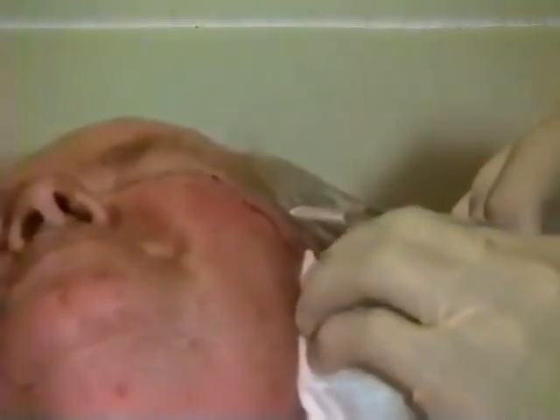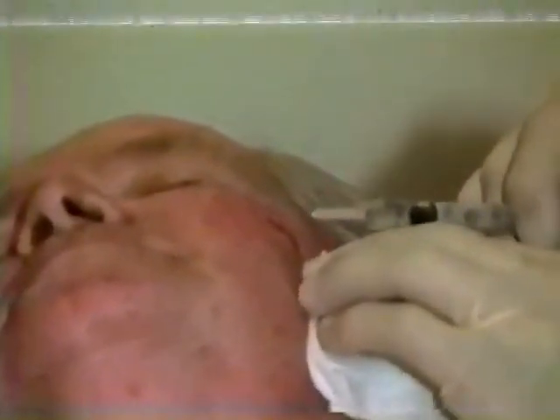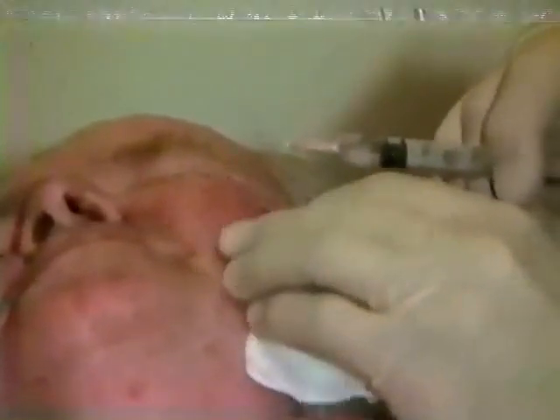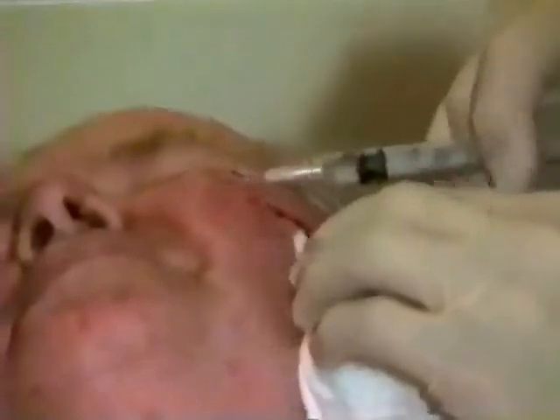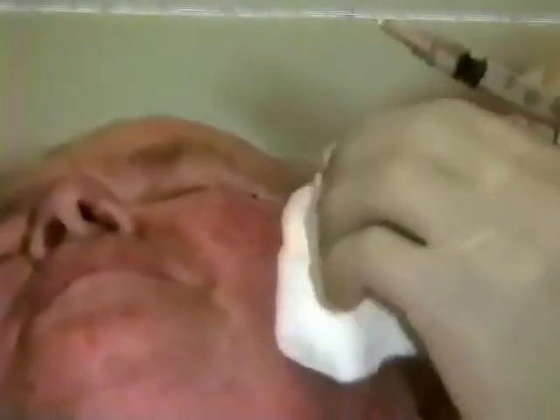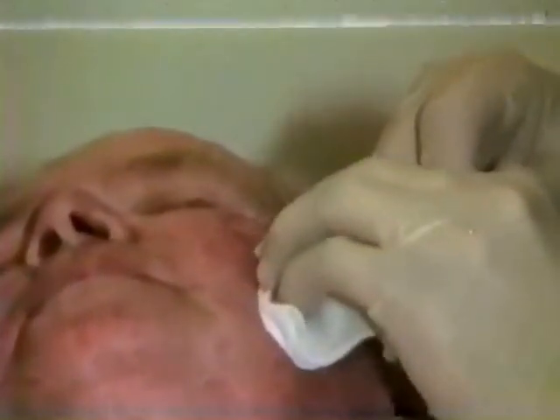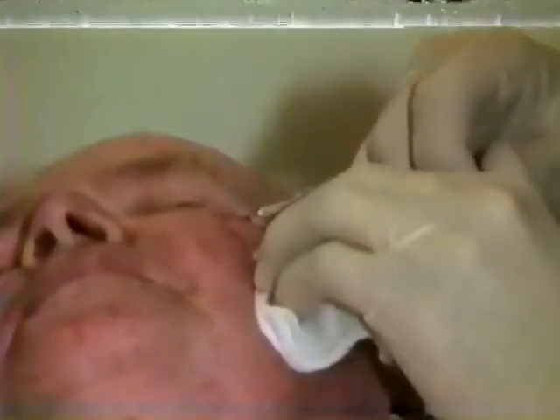This specimen was biopsied several times by Dr. Peppercorn at the Marysville Clinic. We found out that some of this was not tumor. We found out that some was skin cancer and some was relatively deep. Uncomfortable, Esther? Yes, it is. Try not to move your face too much. I know it's uncomfortable.